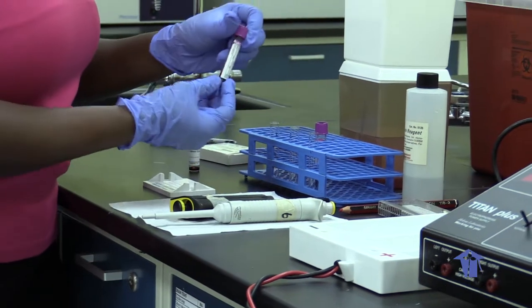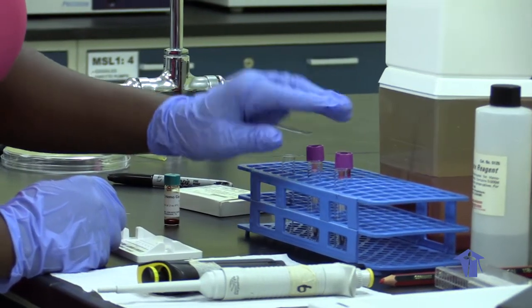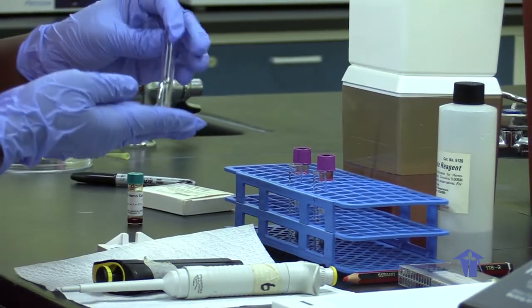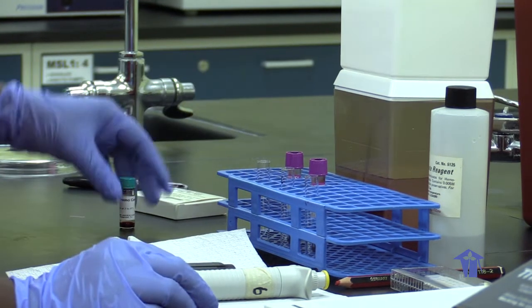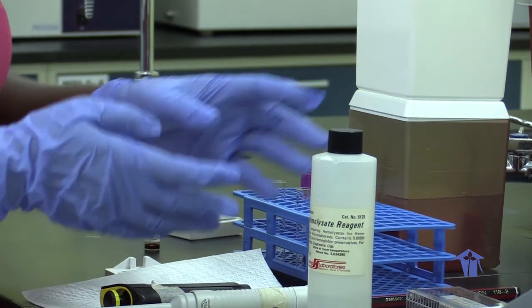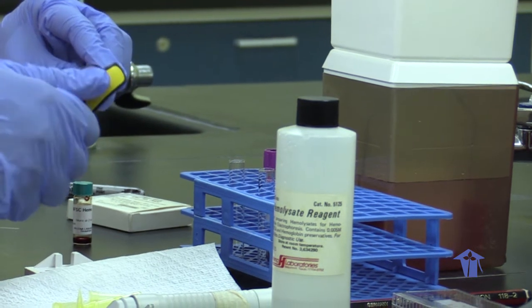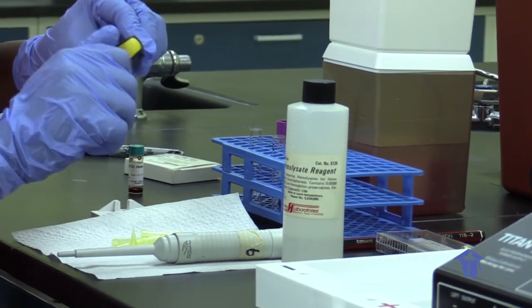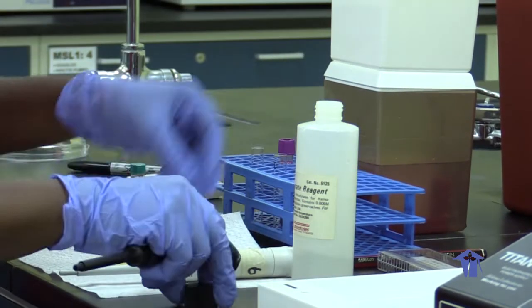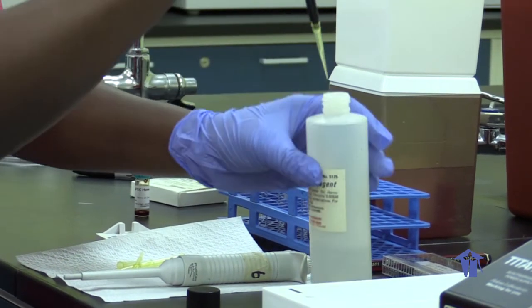So now we have our whole blood samples. Again, we're using whole blood. Then we have our tubes. So these tubes are basically to do the lysing, as I spoke about before, to release the hemoglobin from the red blood cells using our hemolysate reagent. The dilution is basically 1 part whole blood to 3 parts hemolysate. So we're going to use 75 microliters of the hemolysate reagent to 25 microliters of the blood sample.